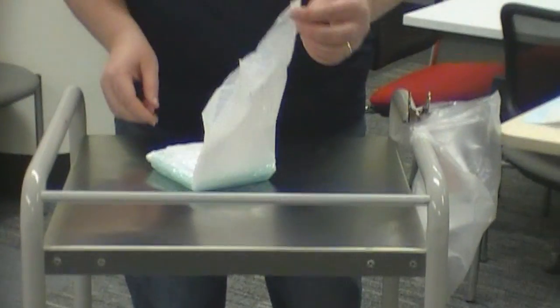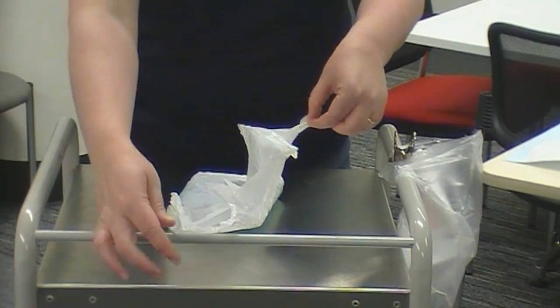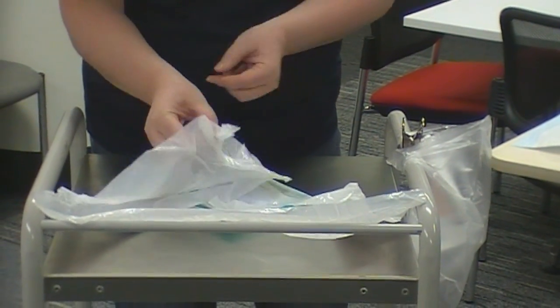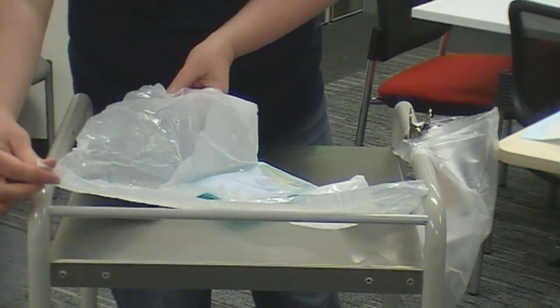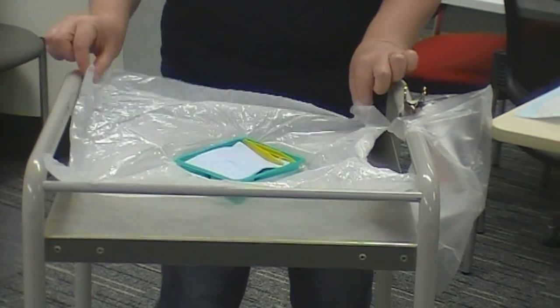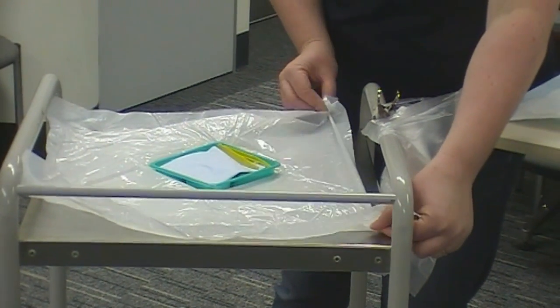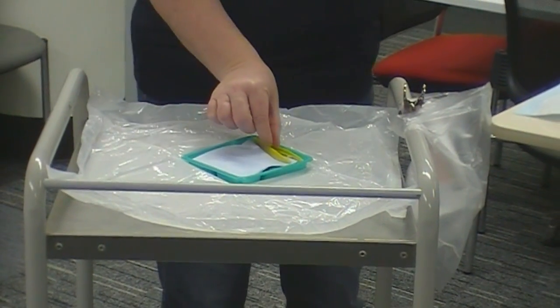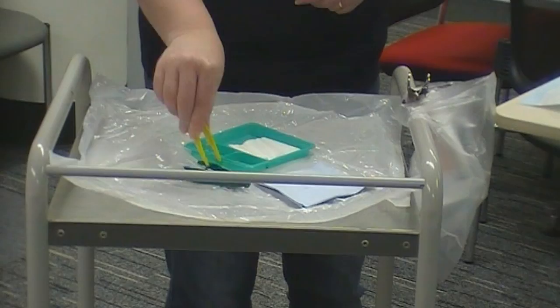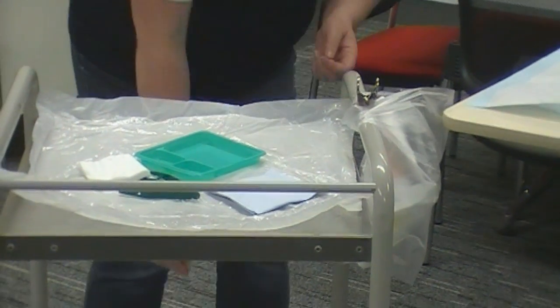Opening one edge at a time, pulling out and making sure that you are grabbing the underside, always opening away from you. You'll notice that I'm not reaching across my field so that I don't contaminate it. Using the yellow forceps I can use those to pull everything out and use for any long dressings, and then they go in the bin.